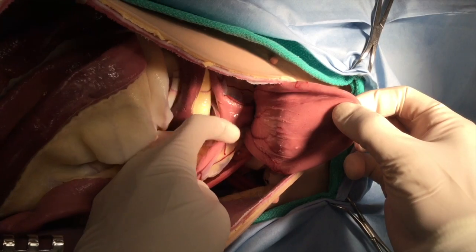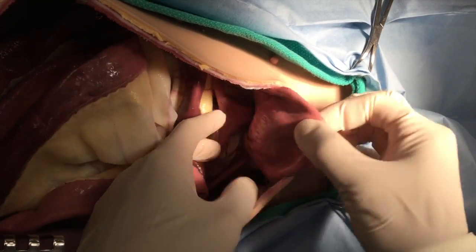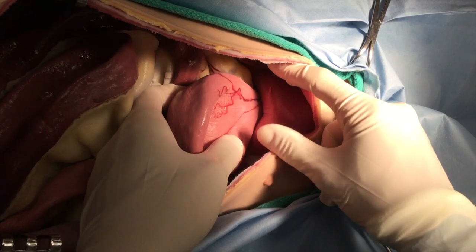Finally, we can identify the bladder. With caudal retraction of the bladder, you can see the uterine body there.